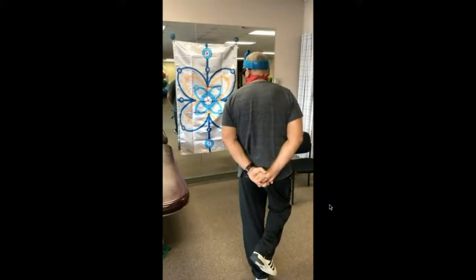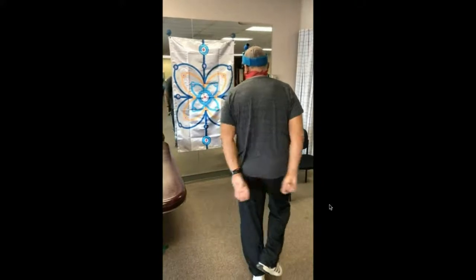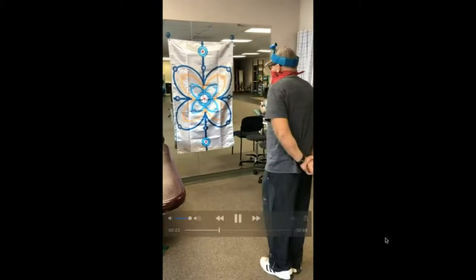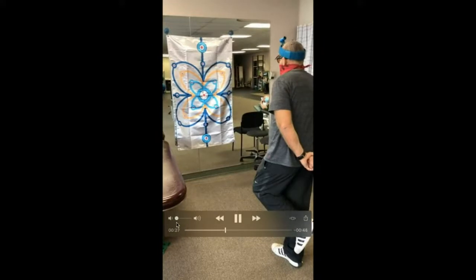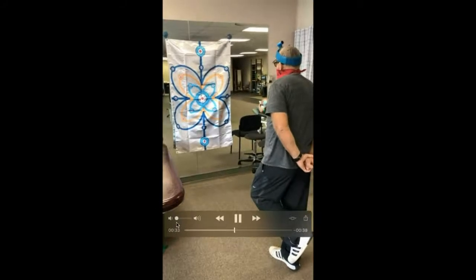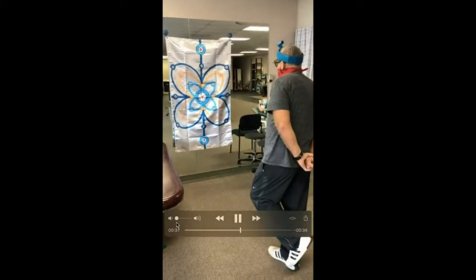And he's doing an infinity pattern, top right to bottom left, and then he can also switch. He's doing the outer blue. Okay. He's also turning his body 45 degrees, which is what he's pointing out there. Again, let me get rid of this audio here. And he can also do the smaller patterns if he feels so inclined to get those in.